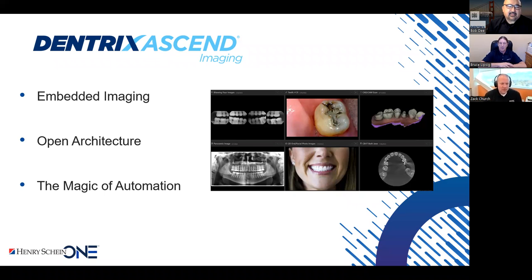Yeah, I want to interrupt you here because there are a lot of companies that can come and say, "Oh, our imaging is great." You guys work for the company. I don't, but I do work closely with Bruce's team, and I know how extensive and comprehensive this imaging team is. As a matter of fact, I always call imaging Dentrix Ascend's main superstar.